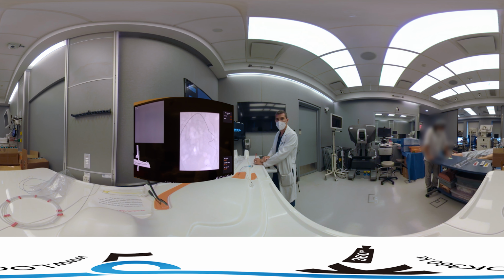I'm going to give a little bit more here and just see if it goes forward. Very, very slow to go forward, right? And if we count it out, 1, 2, 3, 4, 5, I still see it persistent in that uterine artery. So that's a good endpoint for us to stop the embolization on this side.